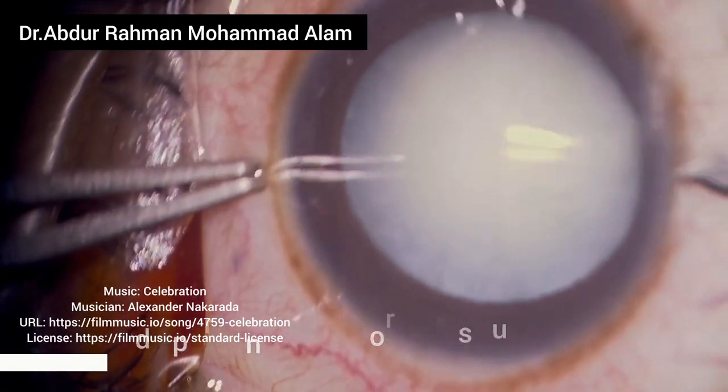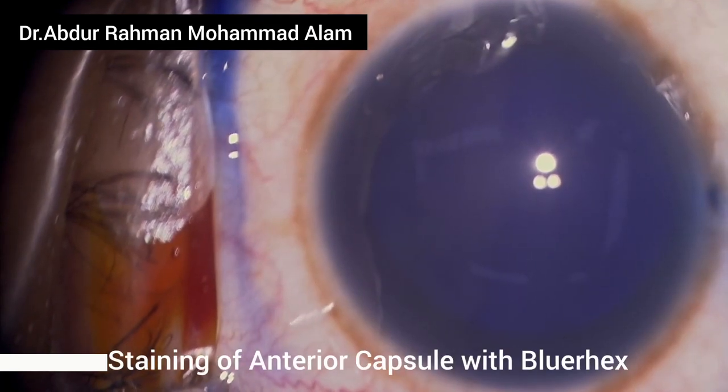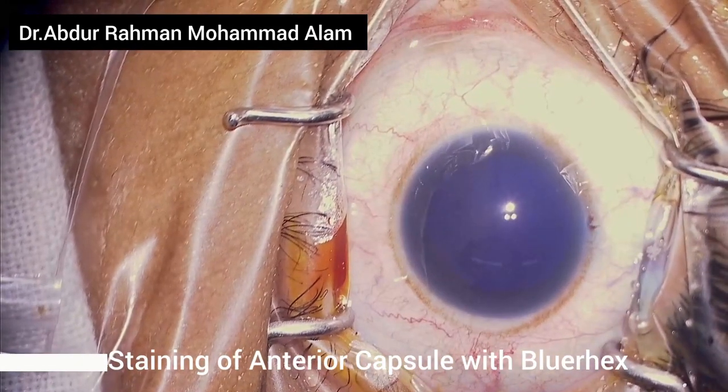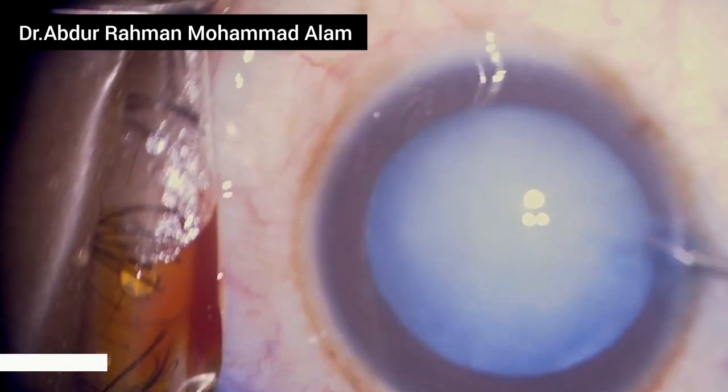Assalamu alaikum. I am Dr. Abdurrahman Muhammad Alam, going to perform a cataract surgery in this white intumescent cataract. This patient is mentally retarded and I'm doing the surgery in general anesthesia.